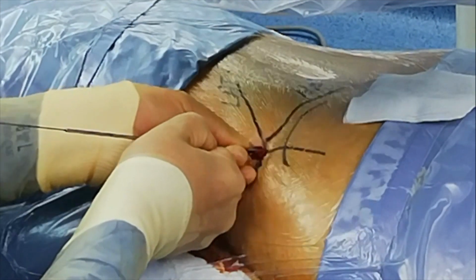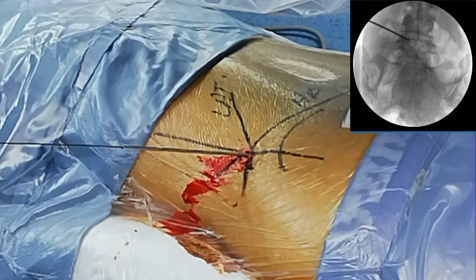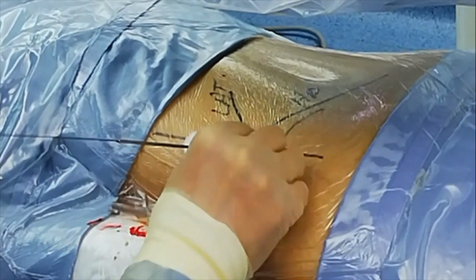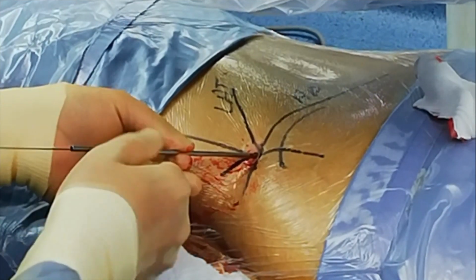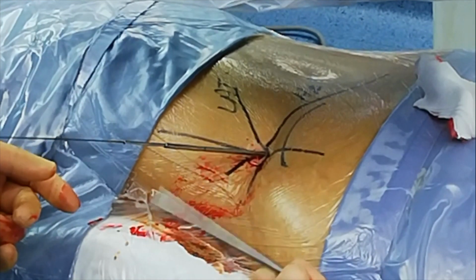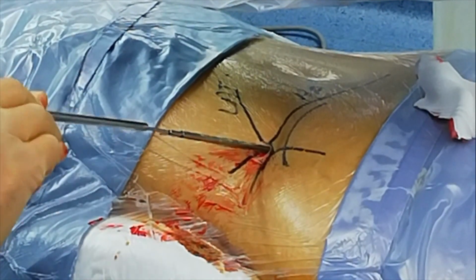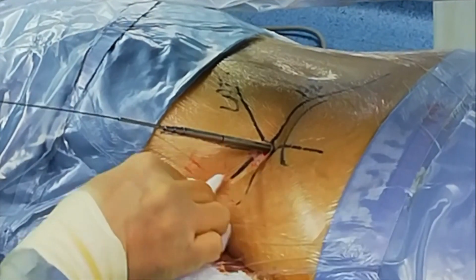So this system here, picture please. Okay, that's very good. So I'm going to put all the dilators for soft tissue dilation. The system here from JoyMax has color-coded dilators and reamers. We have the green sleeve here, followed by the yellow sleeve. As I said, this is only for soft tissue dilation. And then the red one, like traffic light colors. So green, yellow, and red.